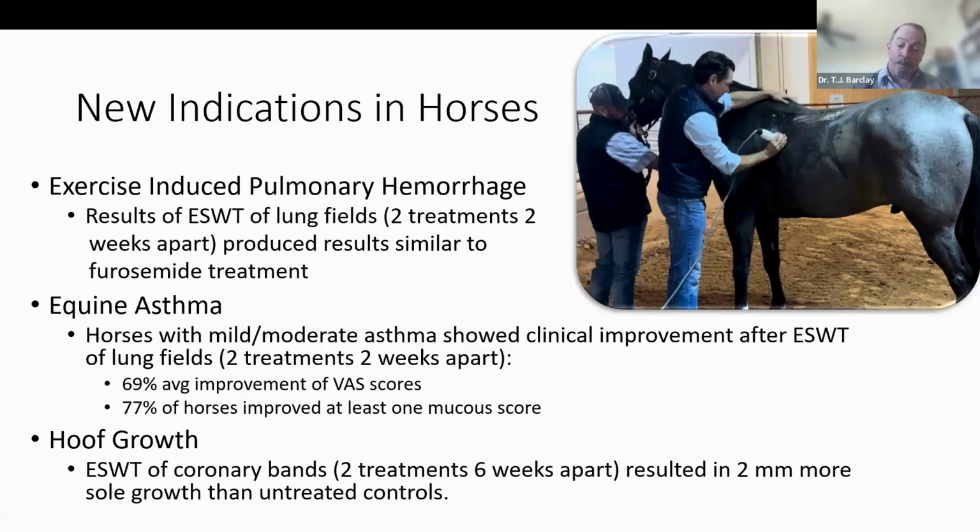All of us in equine medicine see these horses with thin soles every day, and this is another potential tool in the box for getting those horses to grow more sole and resolving their lameness.